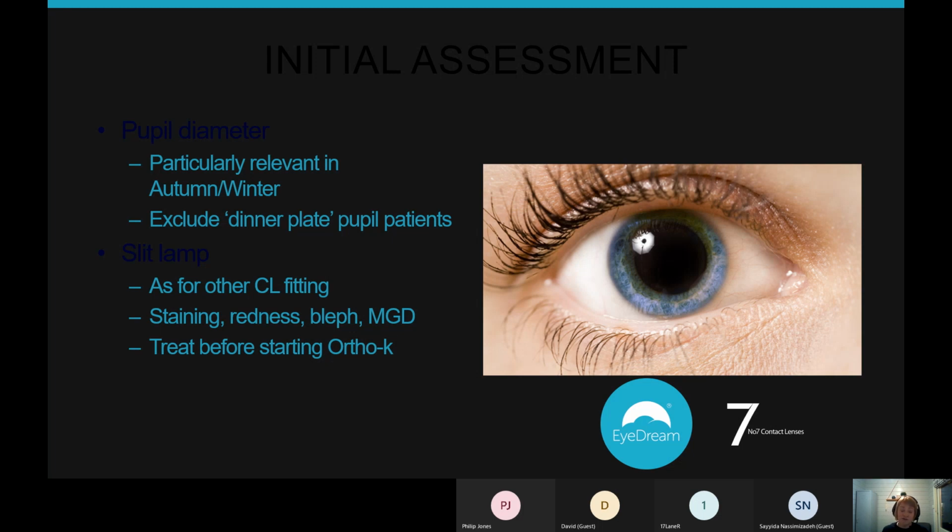And that goes along with the fact that their brain gets adaptation, so their brain gets better and better at switching off that glare and flare, and therefore their vision is likely to improve. If you have a real problem with glare and flare, you could always think about ceasing treatment at that point and picking it back up in May or June, because by the time the patient gets around to the autumn and winter again, they're usually well adapted and don't have that problem.